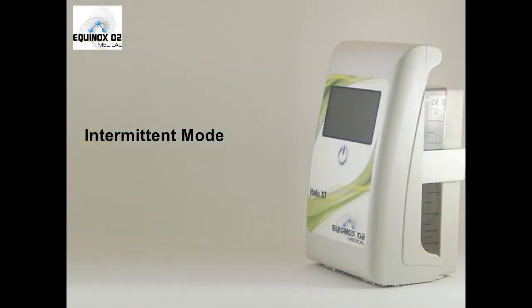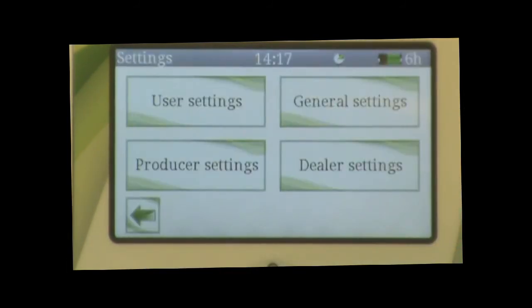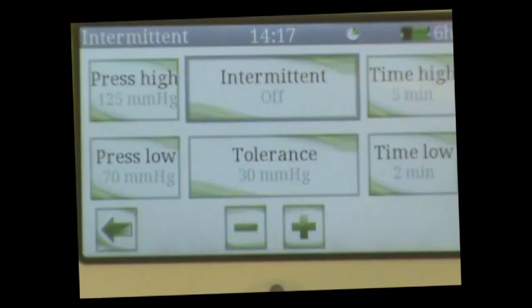Intermittent mode setup: Press the menu button, user setting, intermittent setting. Press the intermittent button and then the minus sign or plus sign to turn it on.